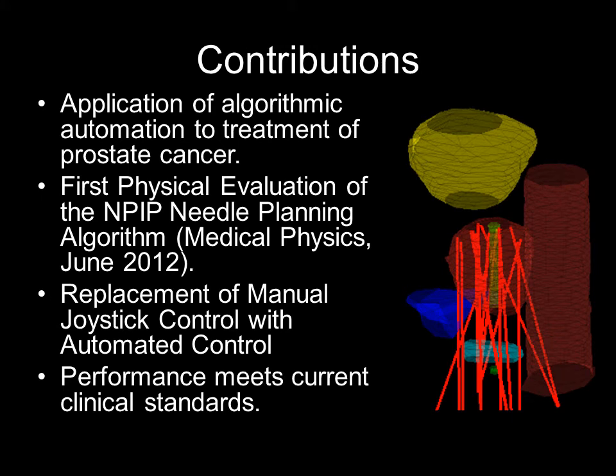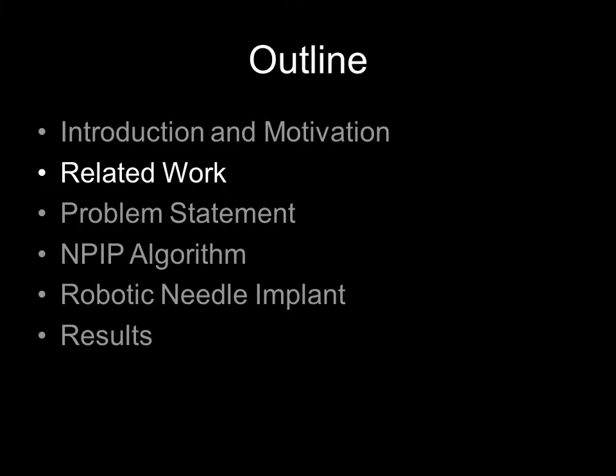Automation seeks to improve reliability and quality of processes. Our goal is to automate high dose rate brachytherapy. A new algorithm from our lab optimizes needle configurations using Skew-Lines instead of parallel needles. This results in sparing trauma to healthy tissue and still delivers the prescribed dose of radiation to the cancerous tissue. Further, we autonomously implant the computationally generated configuration with a specially designed robot.